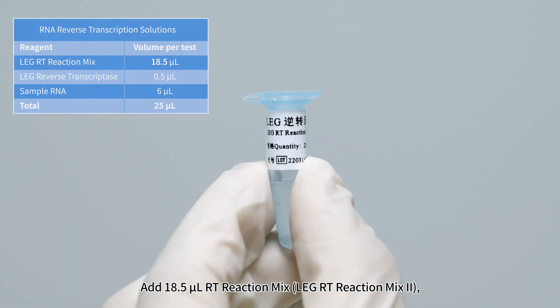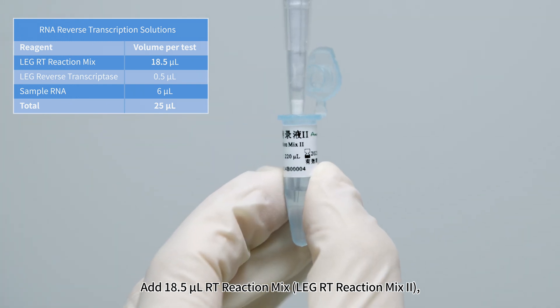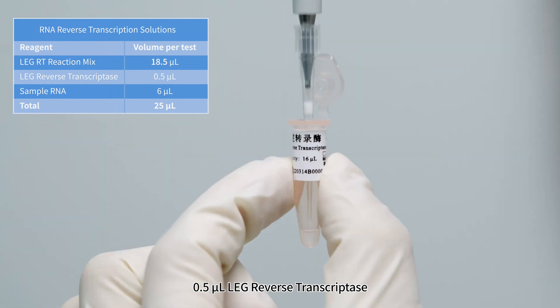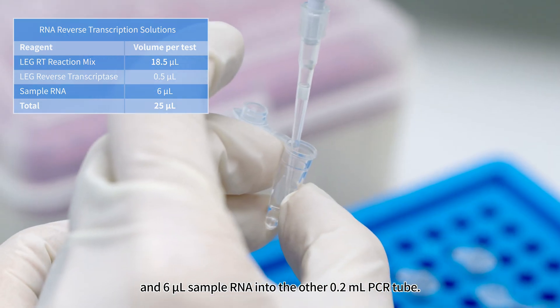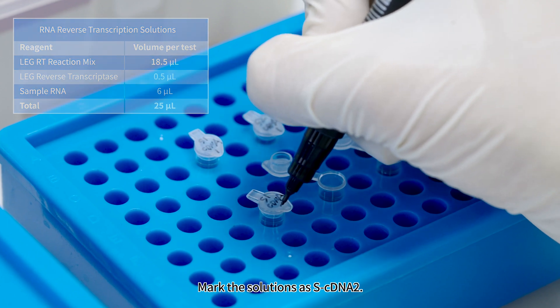Add 18.5 microliters LEG-RT Reaction Mix 2, 0.5 microliters LEG Reverse Transcriptase, and 6 microliters sample RNA into another 0.2-milliliter PCR tube. Mark this solution as SCDNA 2.